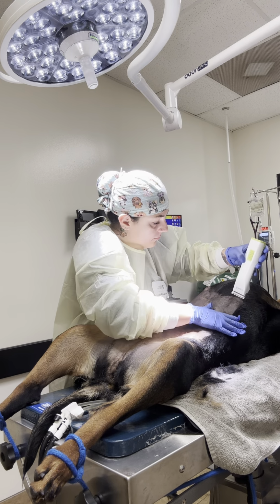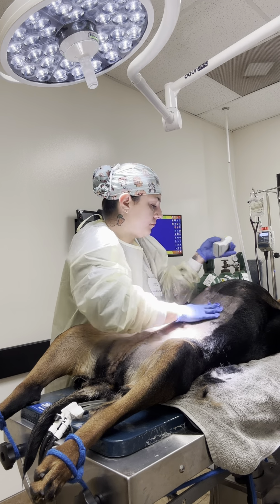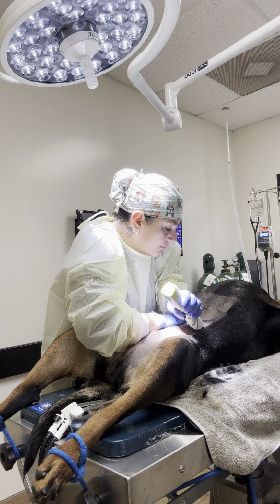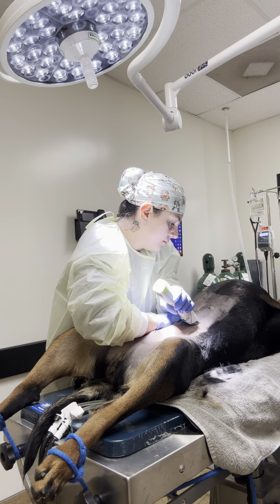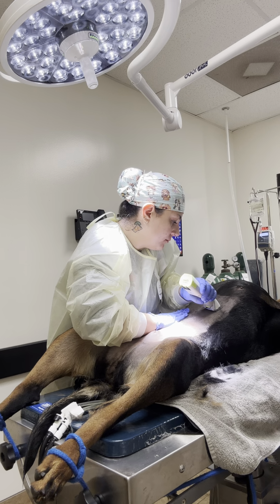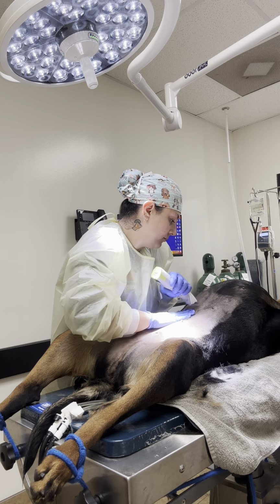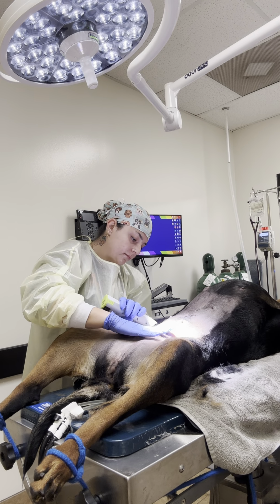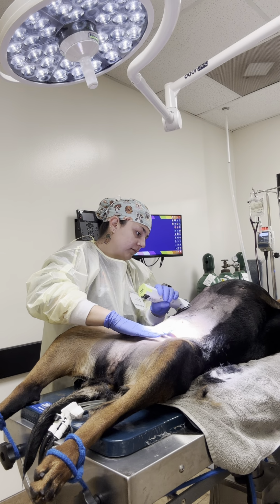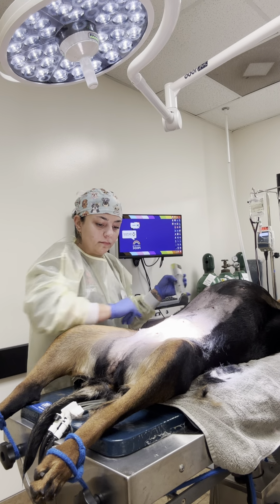We may have to give the other half to get to where you're going, and that would still be at the 1.17 mark. Now I have noticed 3 AV blocks in this run. 1, 2, 3. That's almost a progressive AV block, so that is a little bit concerning to me, so let's do the other half. If you don't want the heart to stop.